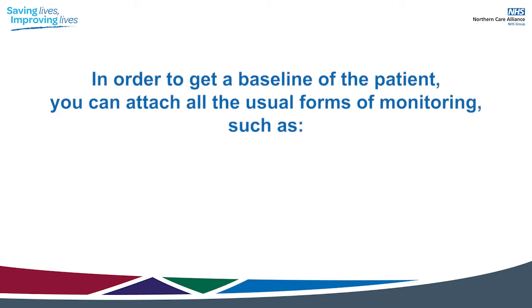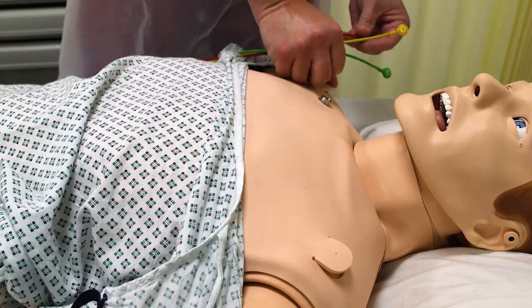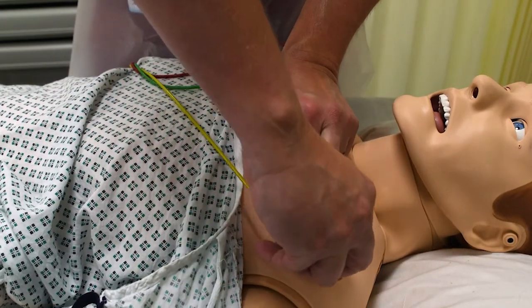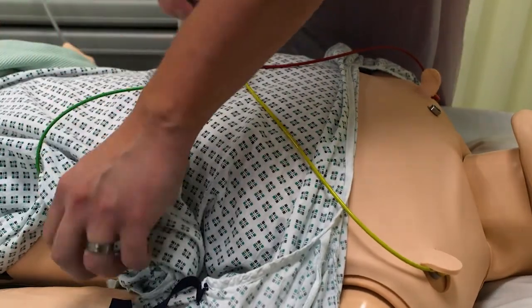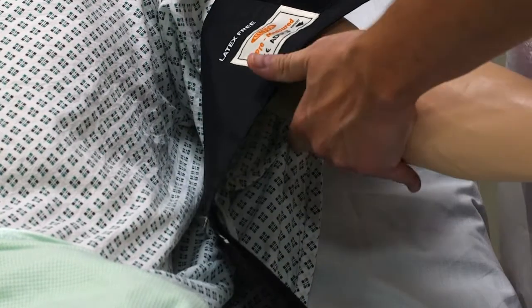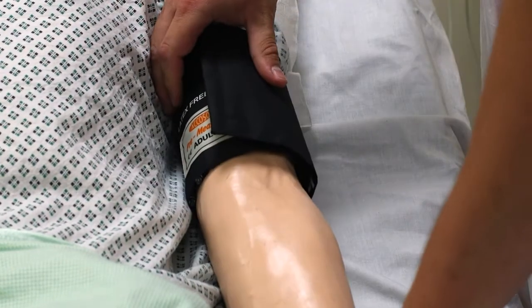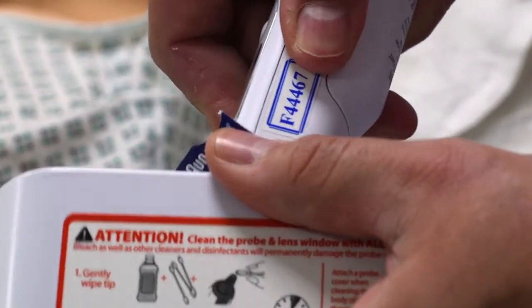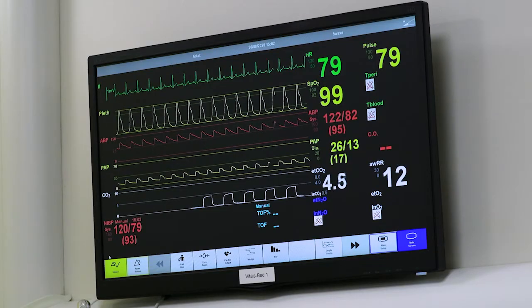In order to get a baseline of the patient, you can attach all the usual forms of monitoring, such as SpO2 monitoring, 3-lead ECG, non-invasive blood pressure cuff, respiration rate, temperature. There will be a patient monitor that will record these observations.